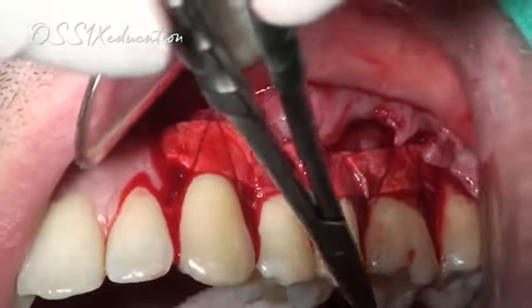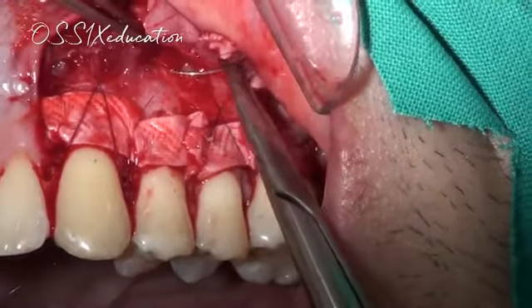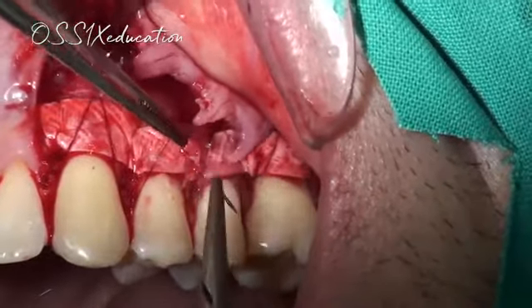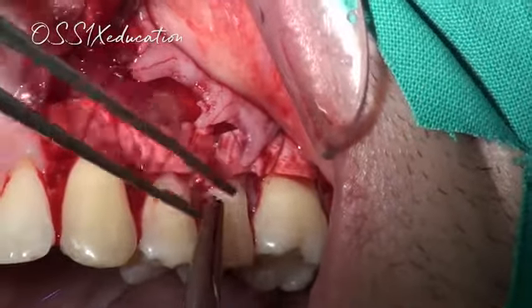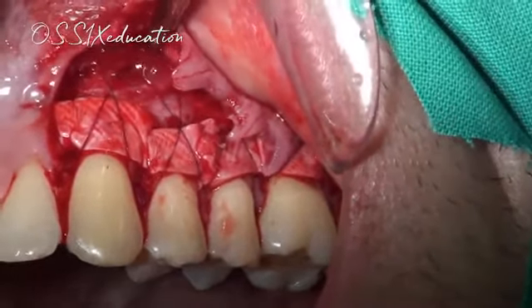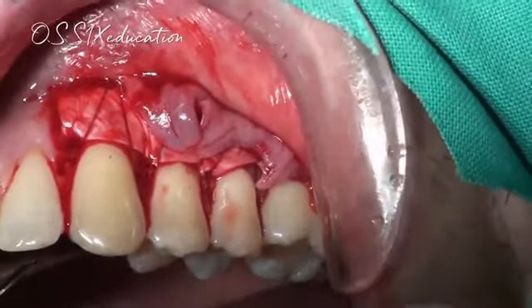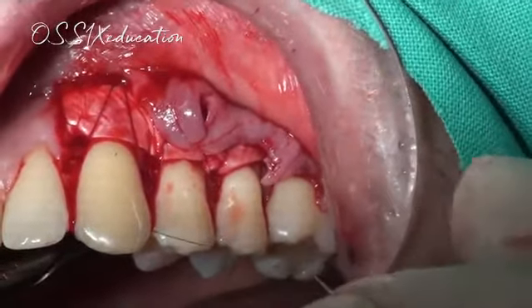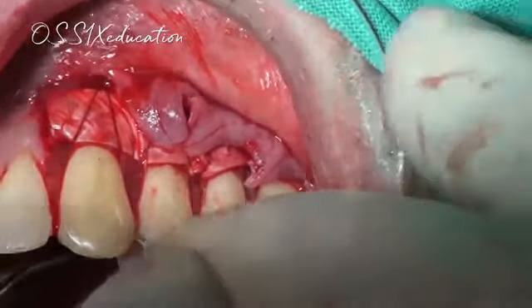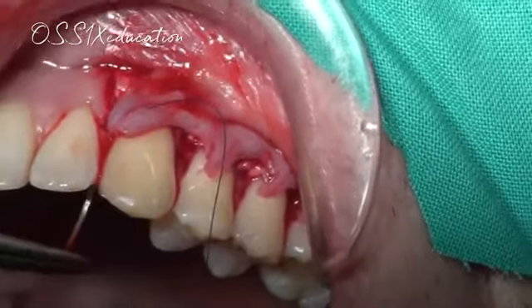I've gathered considerable experience, and I always like to say, and I tell everybody, in the beginning, I thought we could use it as a connective tissue graft, and suture it in the same way. In the beginning, we soaked it and then sutured it, and then I realized that it's not going to work because the scaffold would usually tear.